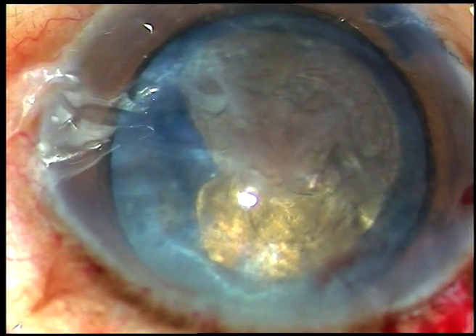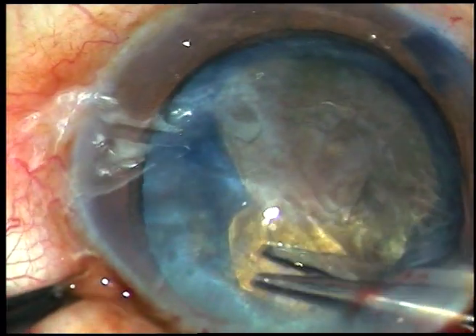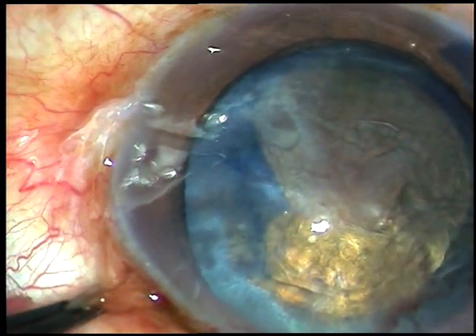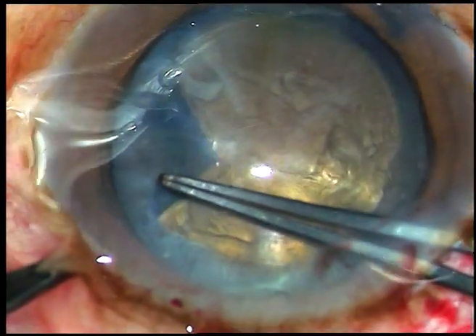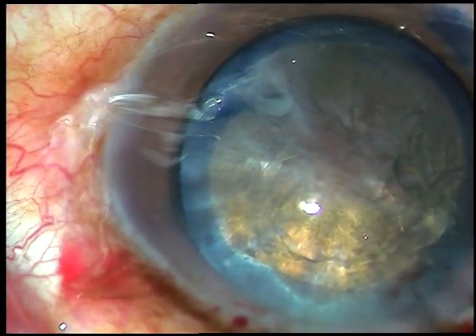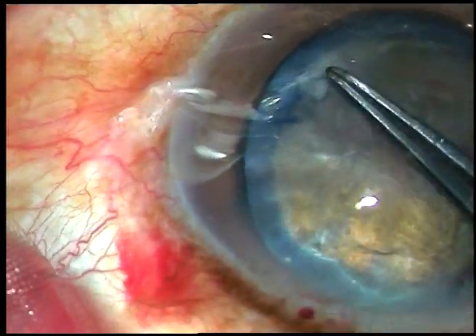I take a Vannas scissor, cut it here at 2 o'clock, and now from here I go — hold this tag, go clockwise up to the fibrous band. That is it. Now I have got an adequate-sized capsulorhexis.